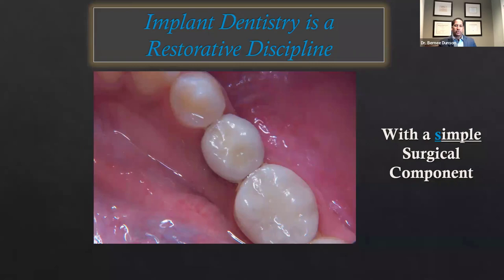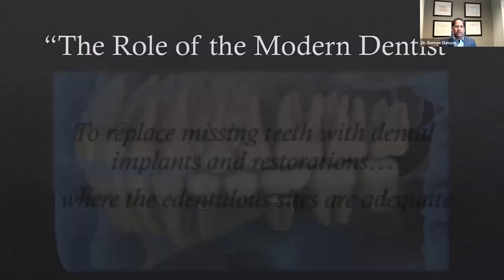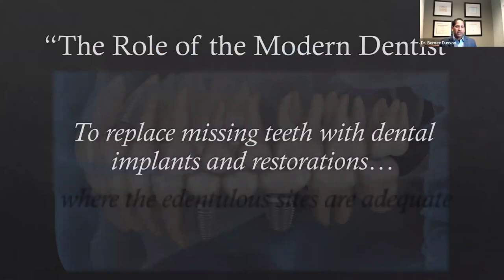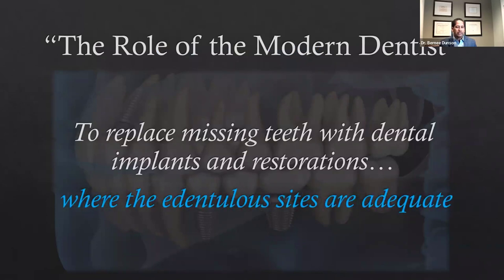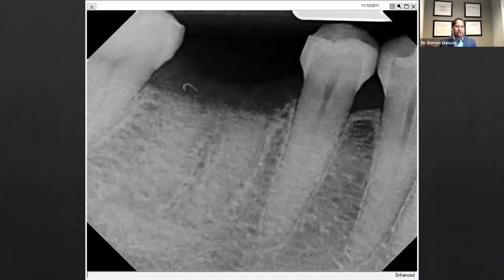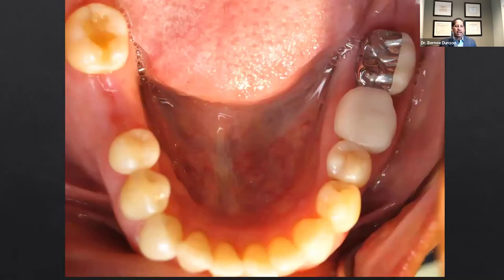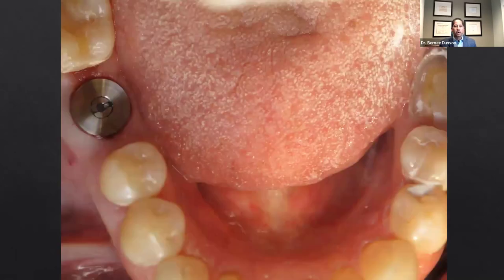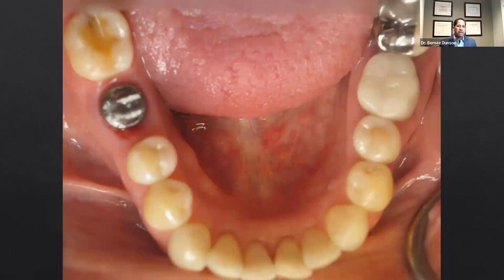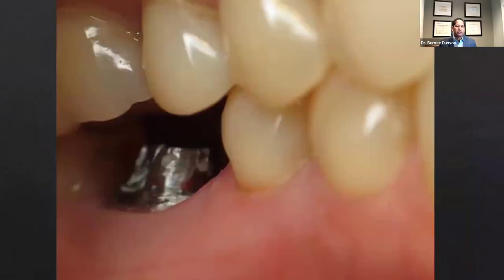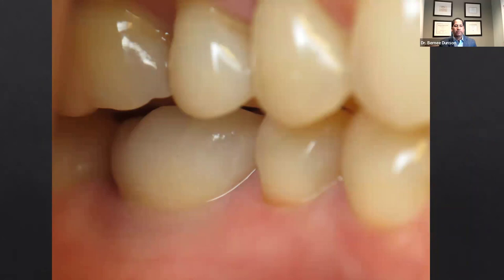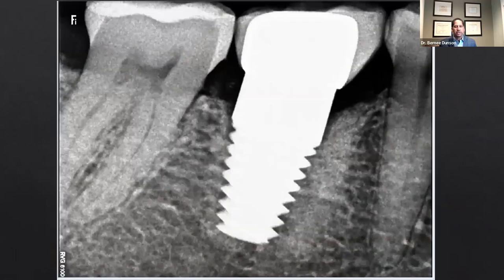With adequate bone — adequate height, width, and length — we replace missing teeth with dental implants and restorations where edentulous sites are adequate and we just go about our process. Here's a case where I extracted a tooth and did a ridge preservation graft. Ridge preservation grafts are significant because they give us width and height and preserve it longer. Having lost this tooth, we place an implant in the posterior molar region, create a prosthetic component after three to three-and-a-half months of healing, and create a restorative solution. Here's that restoration from a lateral view and in place the day it was delivered.